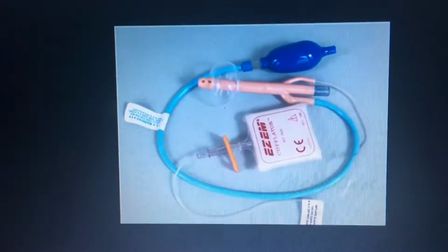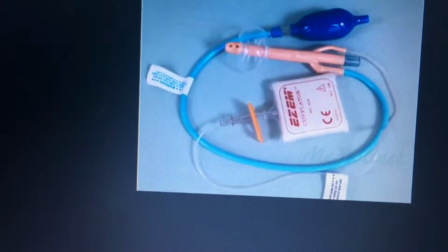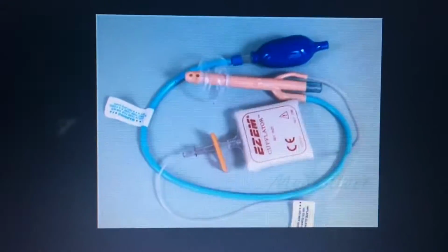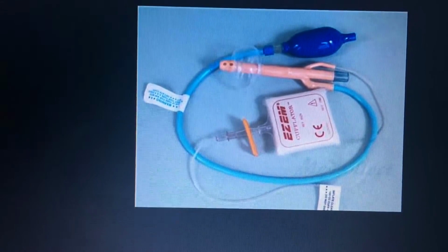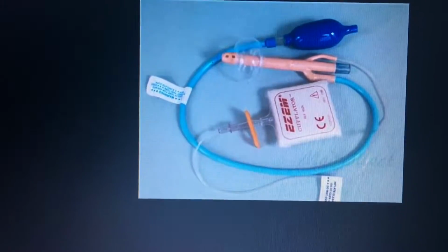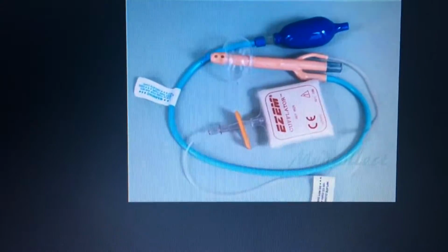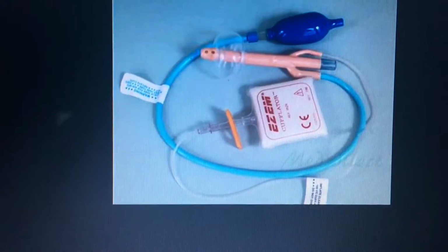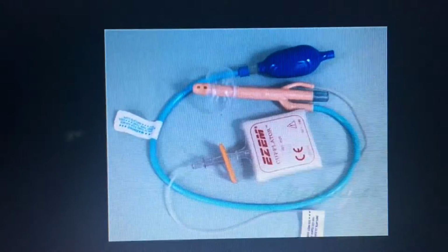So to start off with, my patient's name was Jared. I introduced myself, and first I asked the patient what day he was here for. It was a failed colonoscopy. Next was to ensure that the patient wasn't pregnant, even though he was male. We still wanted to make sure. After that, I asked if the patient ever had this exam done before. He said no, so I told him what will be going on.